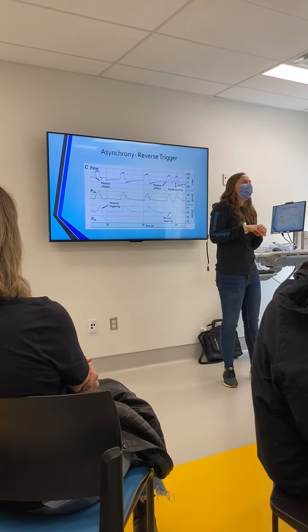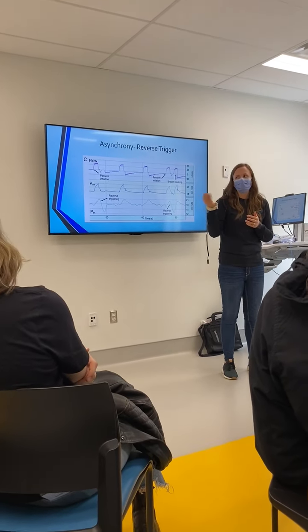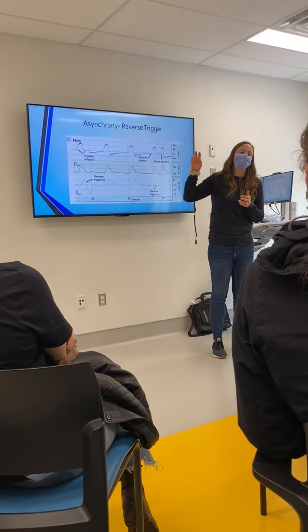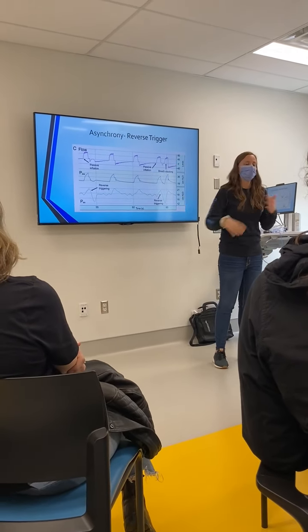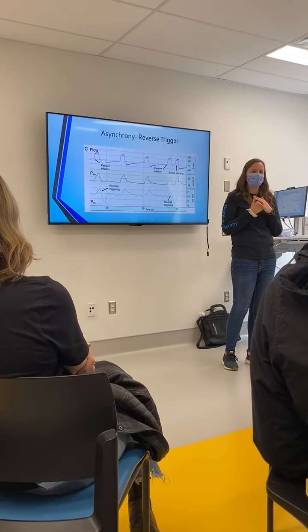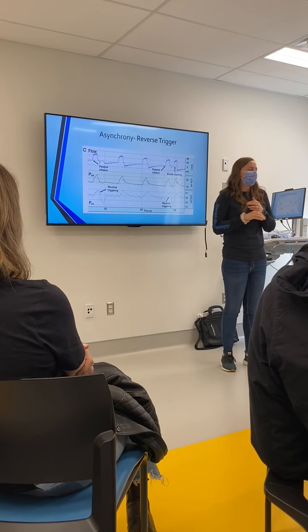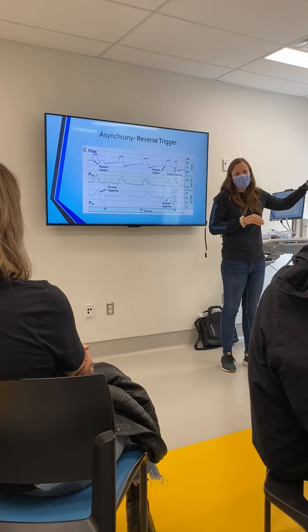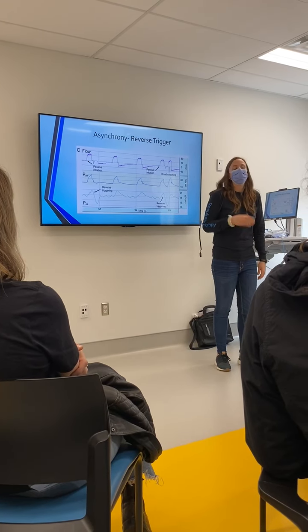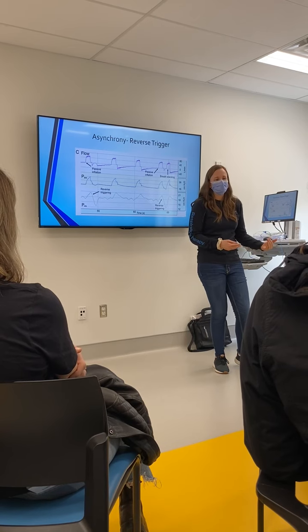So instead of using our transpulmonary plateau cutoff of 25 and a transpulmonary PEEP cutoff of 0 to 10, those cutoffs will be different because the pressures should be different based on what's pressing on the esophagus, if that makes sense. I personally don't know what the number cutoffs are supposed to be. Someone who's studied the measurements when they're prone and supine will know. So it depends on which doc you ask.